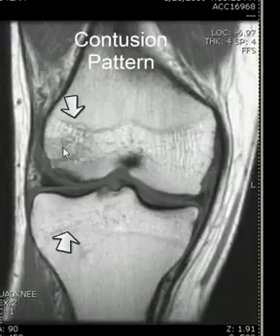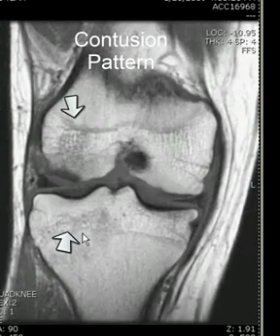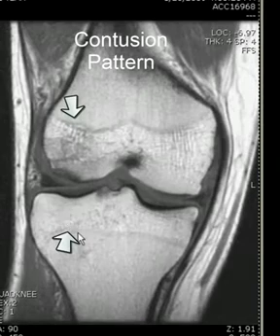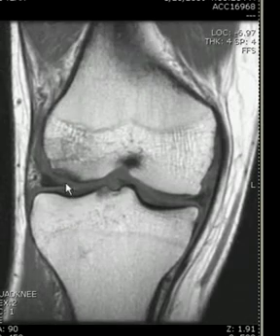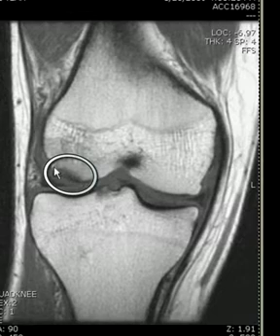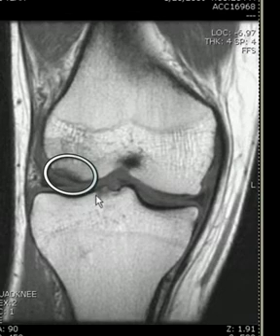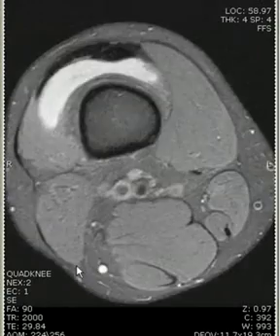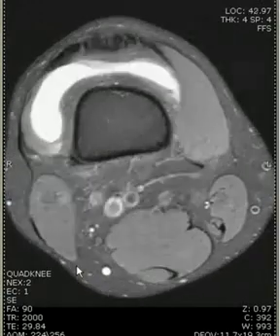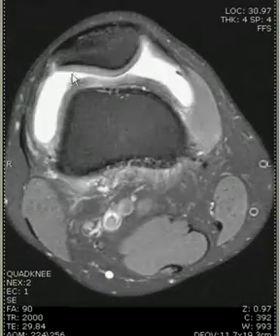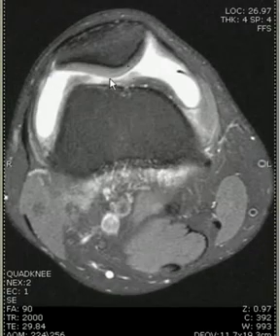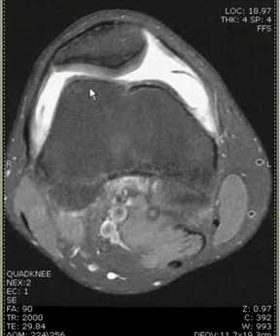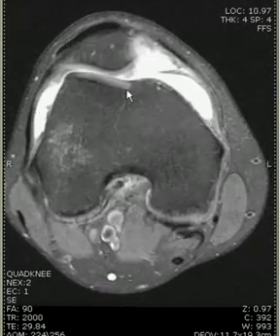We can note the contusion pattern again in the lateral femoral condyle and lateral tibia. Note that there is a small focus of subchondral edema, also likely representing a small osteochondral type injury. On our axial images we will start to look at the patellar cartilage, which is normal both in the lateral and medial facet, and the trochlear cartilage is also nicely seen and normal.